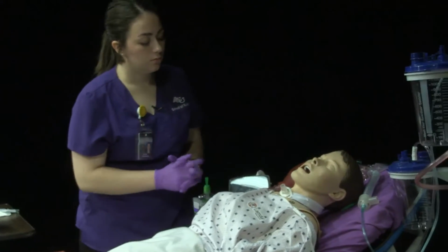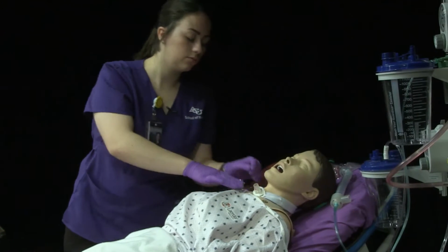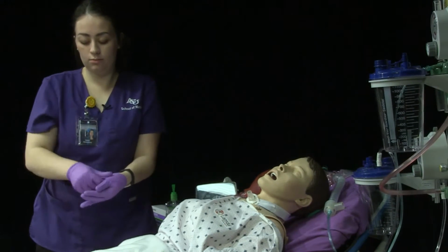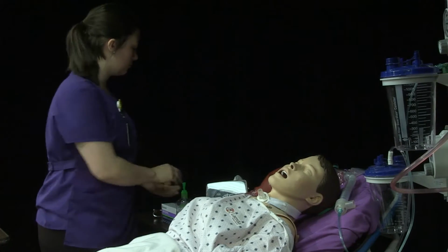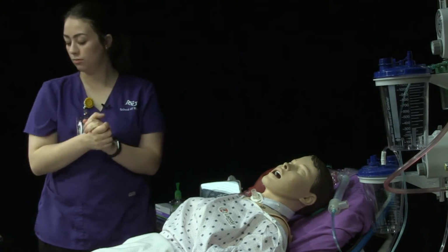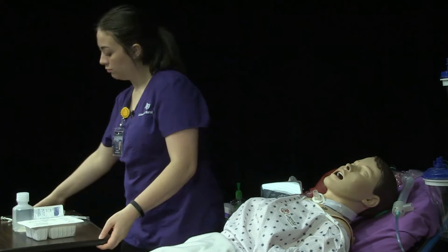Assess tracheostomy site. Remove and dispose of gloves and perform hand hygiene. Open sterile tracheostomy kit, maintaining aseptic technique.